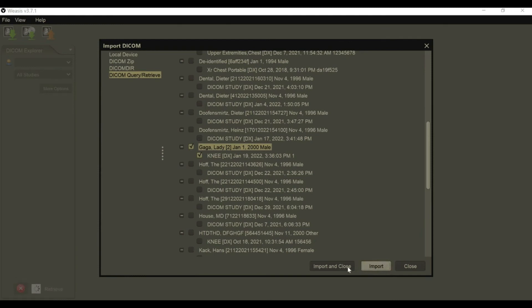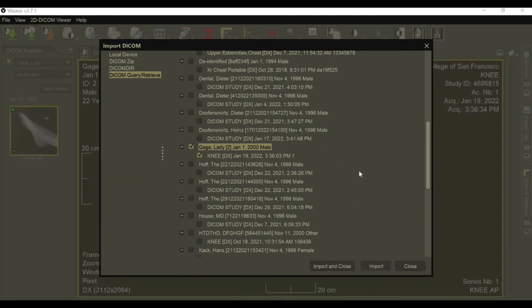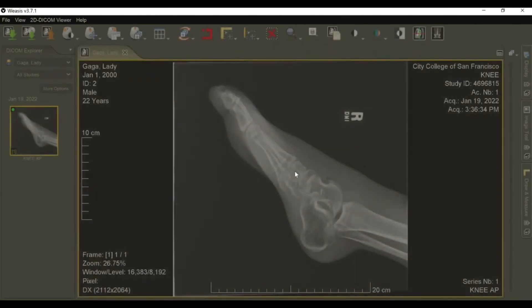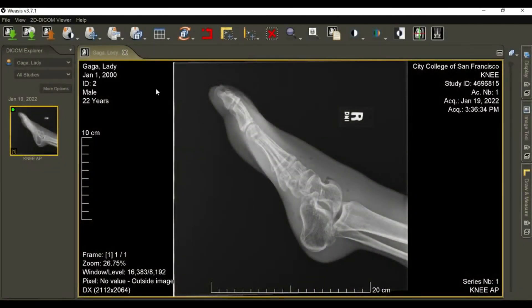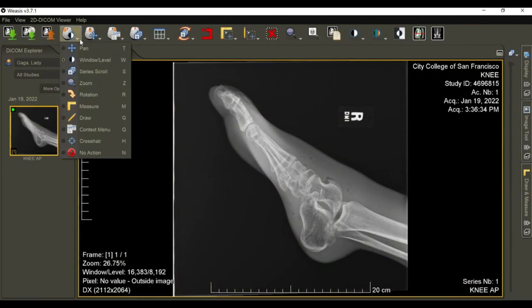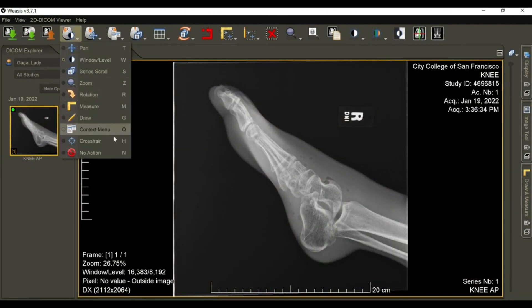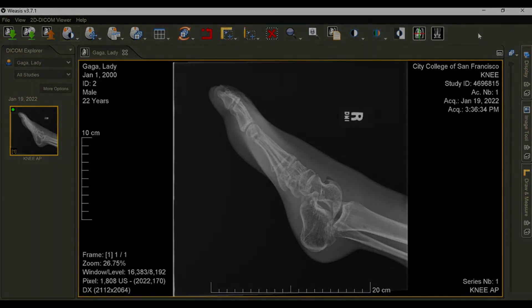You can also select Import and Close, which will close this window and go straight to the study. Here's our study, and we have various tools to manipulate it just as you would any PACS. That's how you do it.